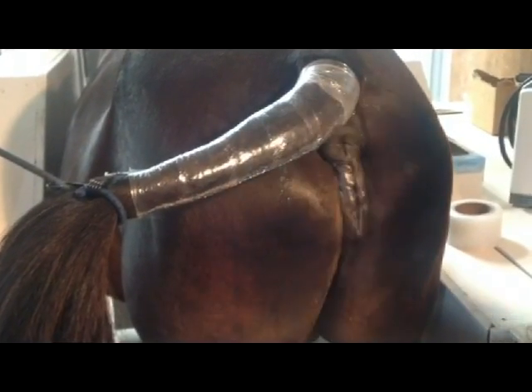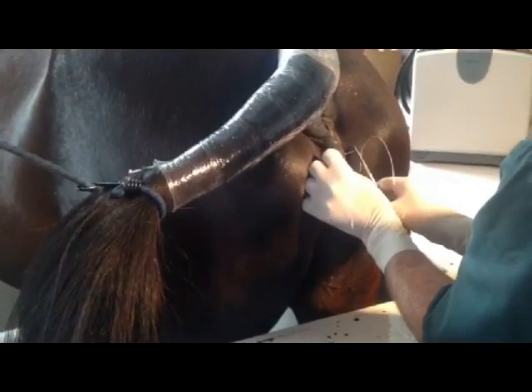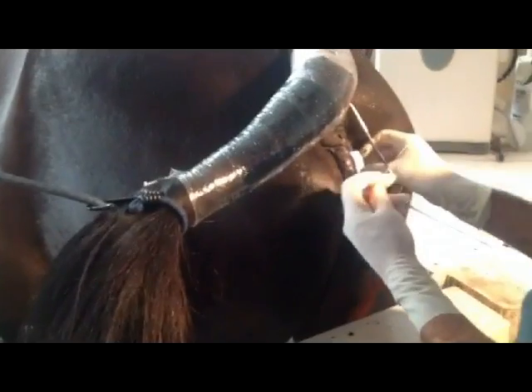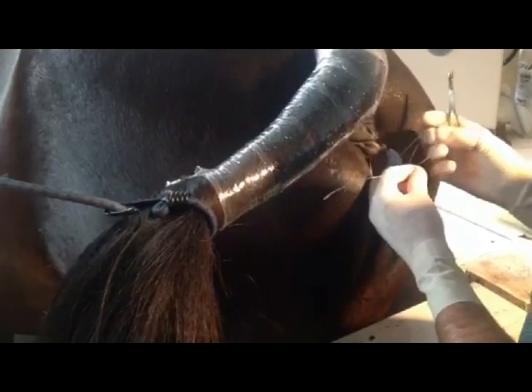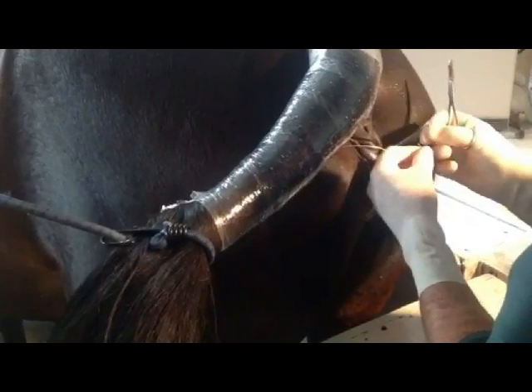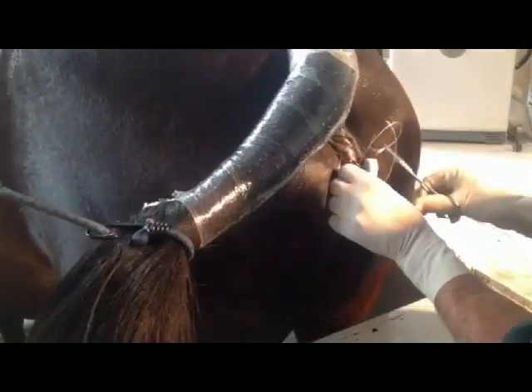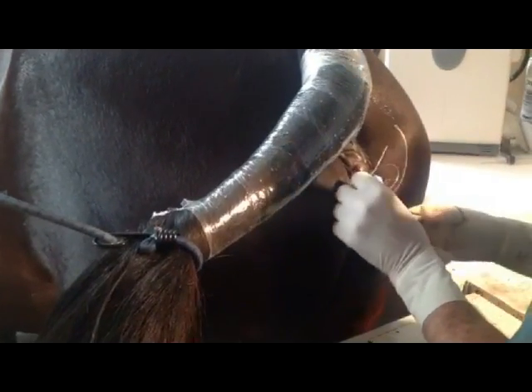With foalings, we prepare our mares the same way, but we actually use a foaling alarm, which we'll show you a little bit further in the video. This is our vet from Cambridge Equine, Paul Fraser, attaching a foaling alarm. We get these out of the States. We have a receiver in our room that will activate an alarm in the room, or if it's not answered, then it goes straight to our cell phone — so we get no false alarms at all. We only get up once to foal the mare, and we haven't had any instances where we've got up because the alarm triggered on a false alarm. When we're working full time, that's pretty important to us.